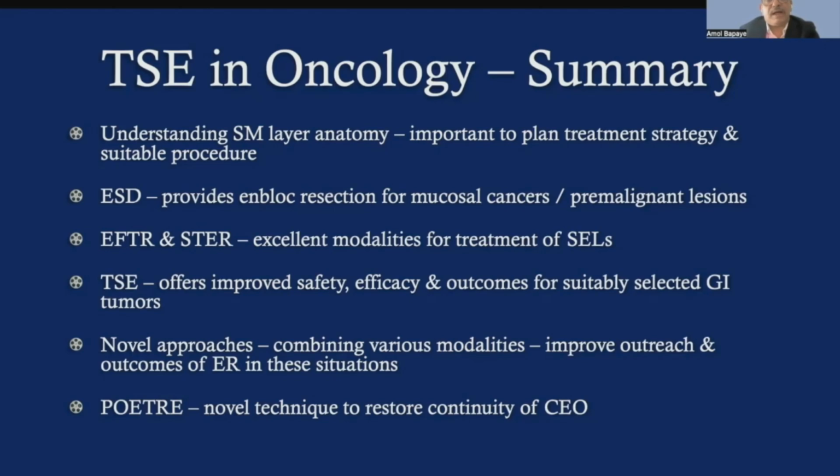ESD, as we all know, provides an en bloc resection for mucosal cancers and pre-malignant lesions, whereas EFTR and STER have shown excellent modalities for treatment of subepithelial lesions from the MP layers. Third space endoscopy in general offers improved safety, efficacy, and outcomes for suitably selected GI tumors, and novel approaches which combine various modalities like endoscopy and surgery, endoscopy and chemotherapy.